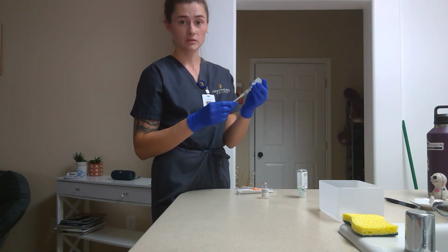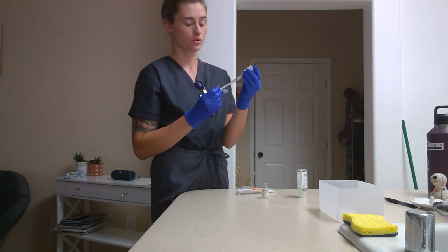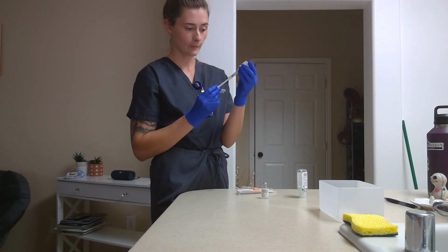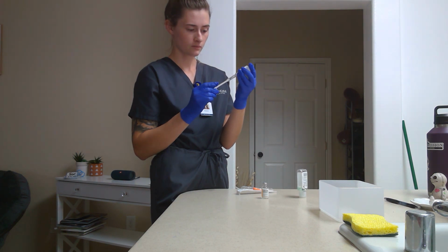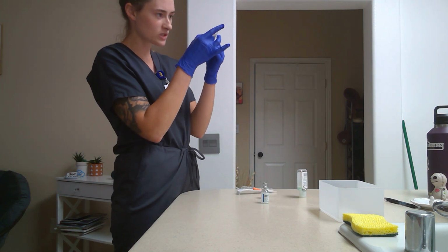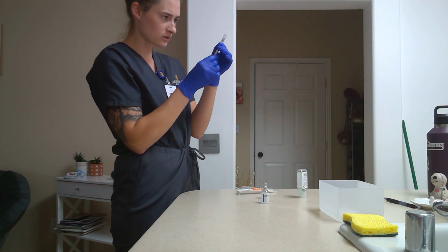And I'm comparing this again to my electronic health record to make sure that this is correct. Do not go over and draw more, because you can't push them both back into the vial. So 8 and 4 is going to be a total of 12 units. Perfect. Just going to be checking to see if I have any bubbles whatsoever. Everything looks good. I don't have any bubbles, and I have exactly 12 units.